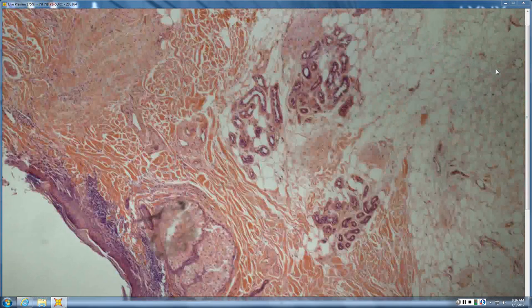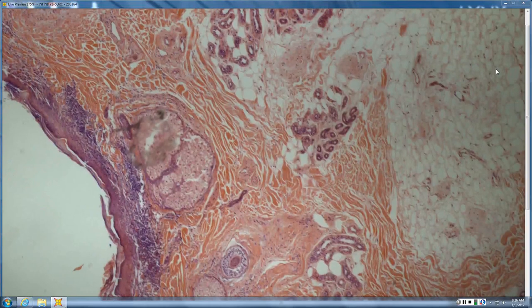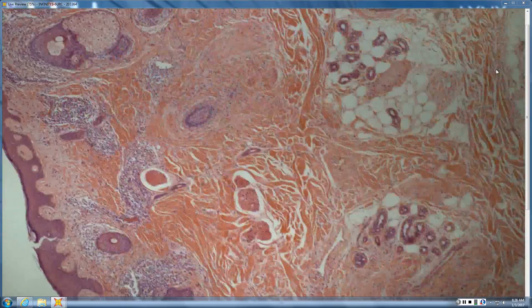So if it's LPP, it would have to be super early where you haven't lost any. Or that could just be a little superficial, like a seborrheic type folliculitis high, if there's no loss elsewhere, and that would go more with pattern. So that would be your differential, with the sebaceous glands weighing in toward maybe not scarring alopecia. This kind of has a lupus look. It's a little deeper, where you might think more towards isthmus, more towards lupus. And if you wanted to know lupus versus LPP, your best study is DIF. Very good. Okay, that's it.